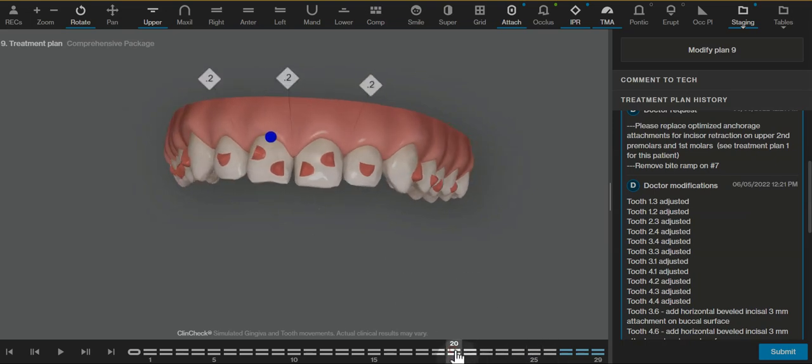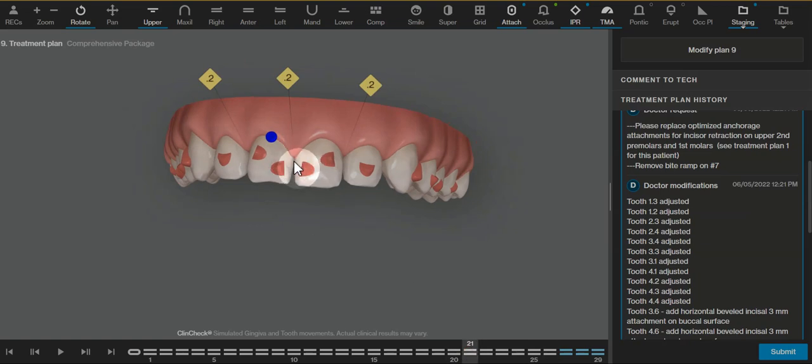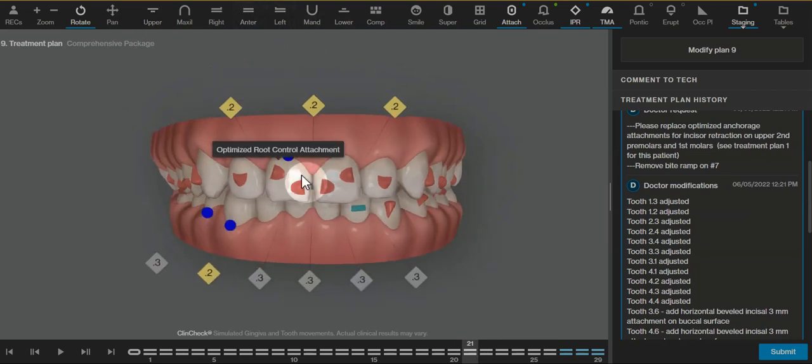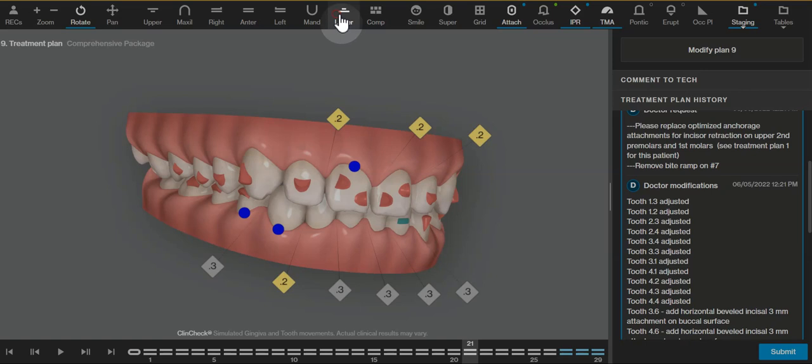If you do find that there is a contact, say like right here, you're going to want to put some topical anesthetic on and just do some really light IPR to relieve that gingival third interference. Looking at the lower arch, these lower anterior teeth need to intrude quite a bit to level the curve of Spee and also get out of the way of the upper teeth.